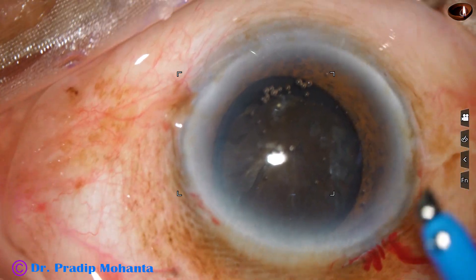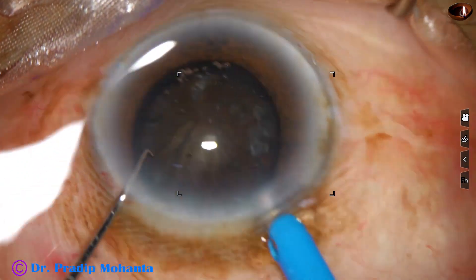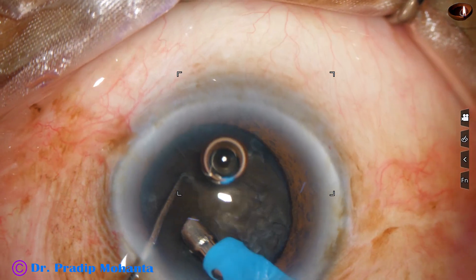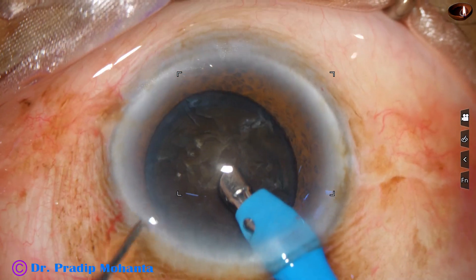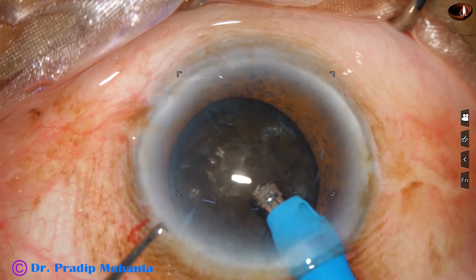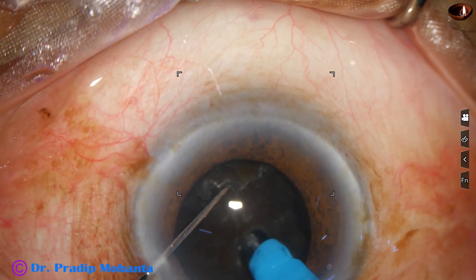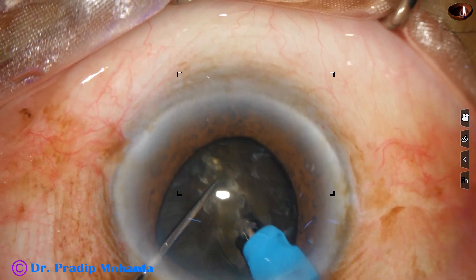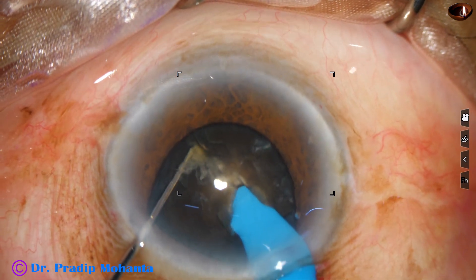Now the tip of the phaco needle is introduced into the anterior chamber. See the exposed part of the phaco needle — it is more than in routine cases. The thickness of this nucleus is huge, more than 5 mm. The needle goes deep into the substance of the nucleus, through the substance towards the opposite equator.